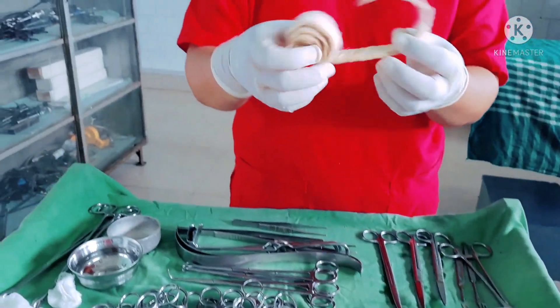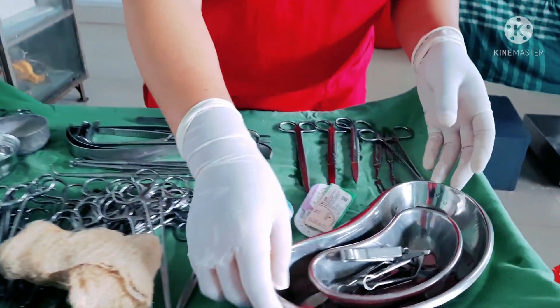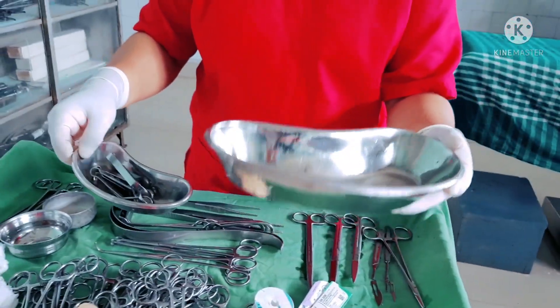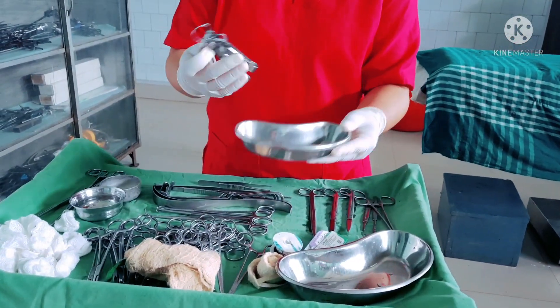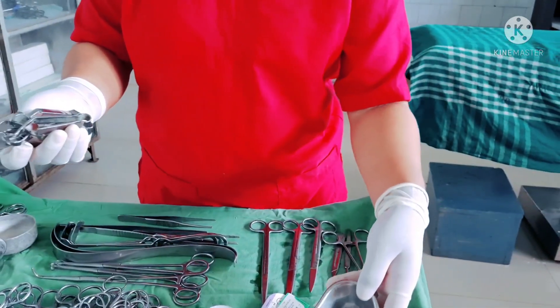We also have a free ribbon gauze which is quite long. We have two kidney trays — one bigger size used to keep the scalpels, blades, and sharp instruments like scissors, and a small kidney tray which is used to keep the specimen of the appendix.